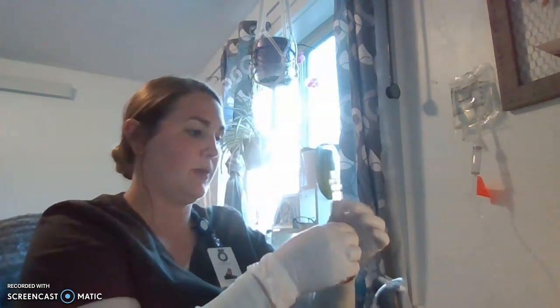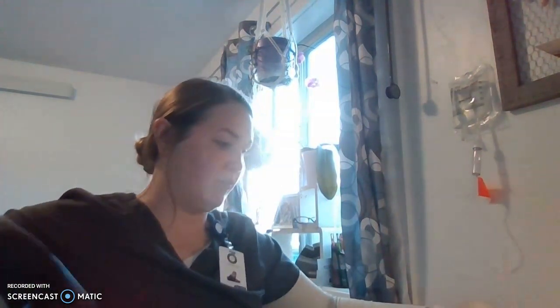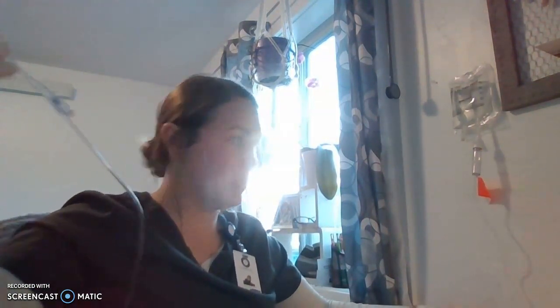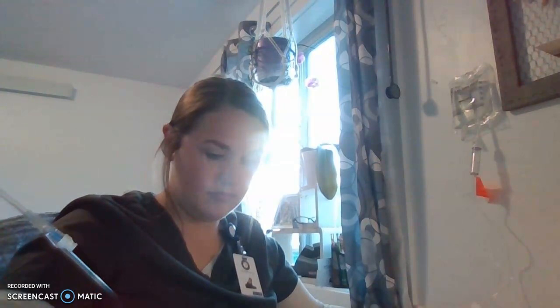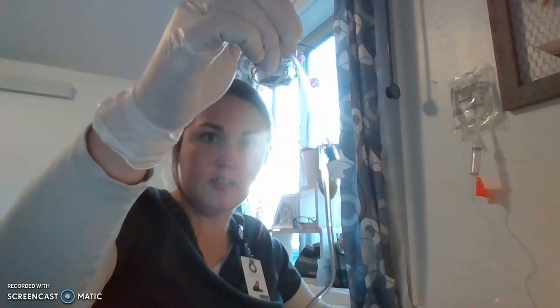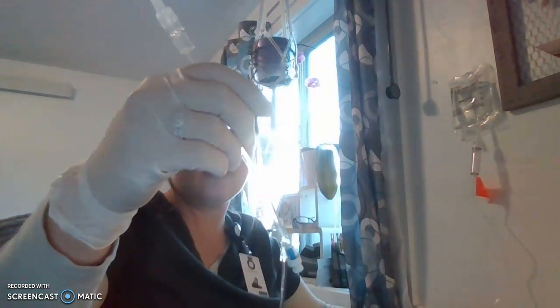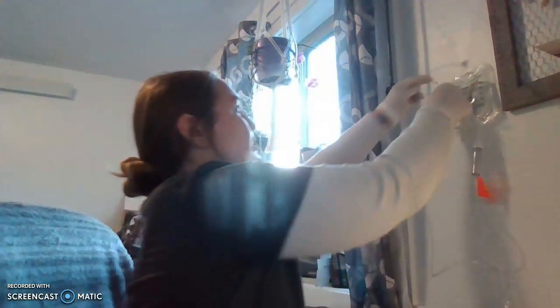Now that I've got that drip rate calculated, I'm going to make sure this tubing is primed all the way through and making sure that there are no bubbles in this tubing. Now that the bubbles are clearing out of our tubing, we can go ahead and proceed.